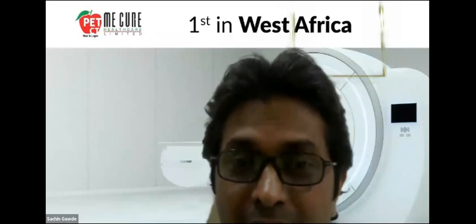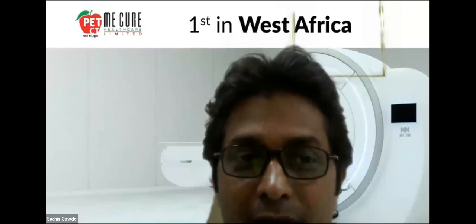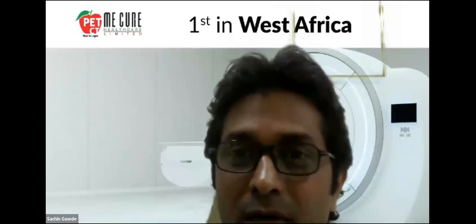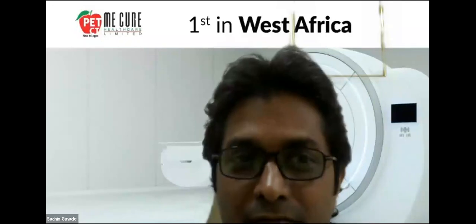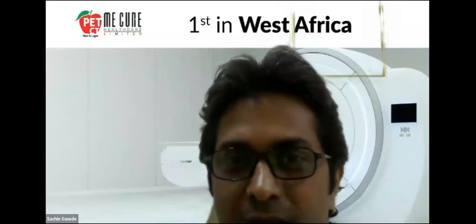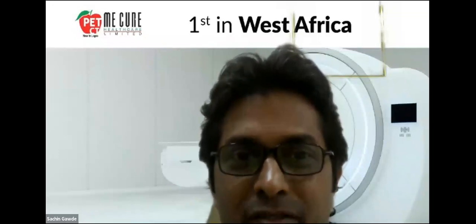But yes, we are going to see a revolution in PET. When Dr. Akin touched upon that, there is some new molecule which is just waiting to get launched called FAPI, which is a gallium-based generator radiopharmaceutical, which will completely change the dynamics of PET imaging in the future.